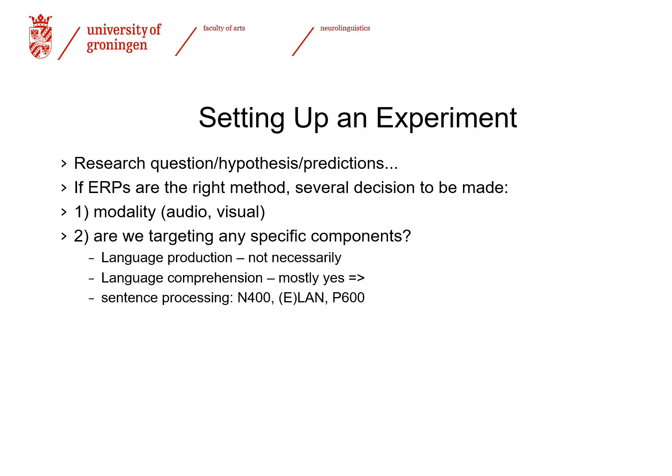So one of the first questions, in case you're doing comprehension, and by the way, I'll mostly be talking about comprehension because it is much more prevalent in the field. You need to decide about the modality of your experiment. Are you doing an audio or a visual experiment? There are reasons to do either.